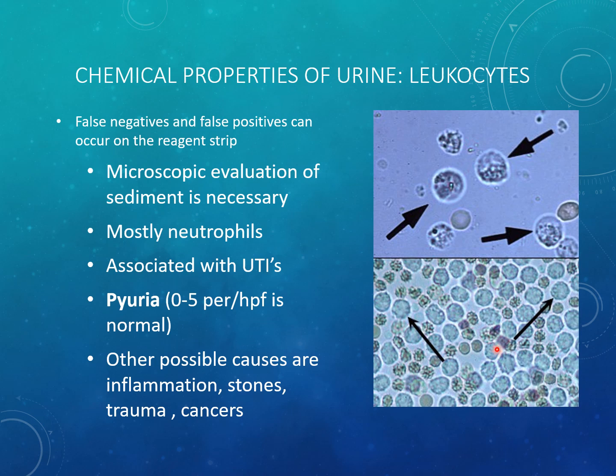When there are white blood cells in the urine, we call it pyuria. When examining specifically for white blood cells, this is an instance where you would want to use SediStain, because cells are going to be easier to see when they're stained. White blood cells and red blood cells may lyse in very dilute or highly alkaline urine.